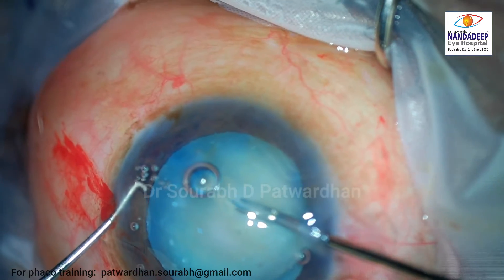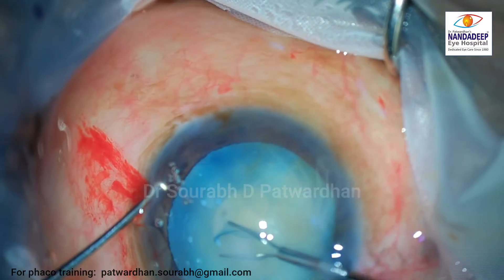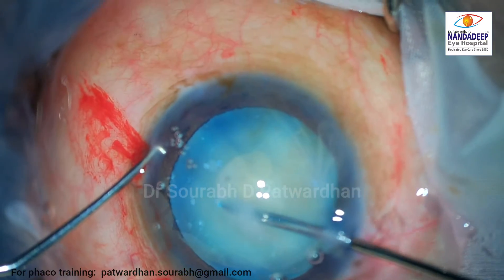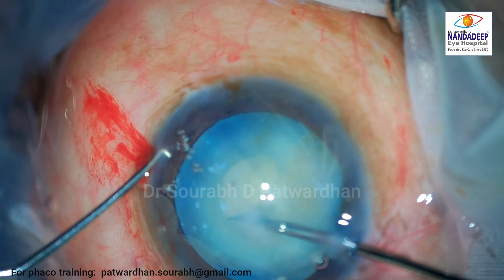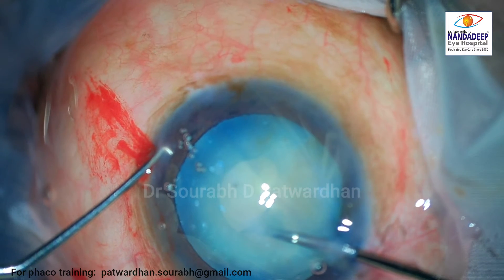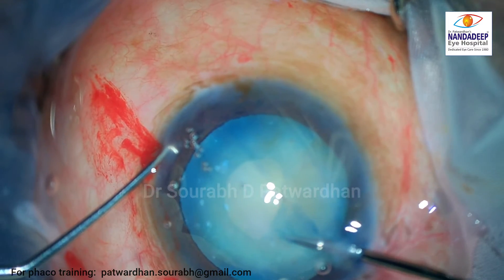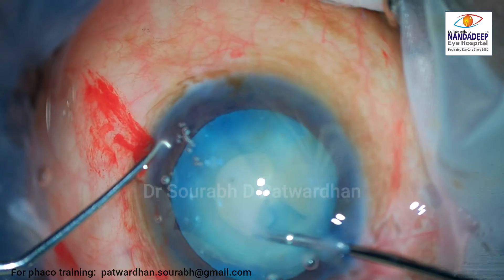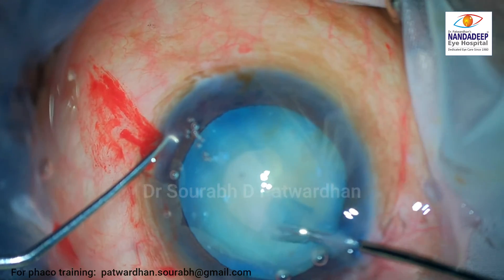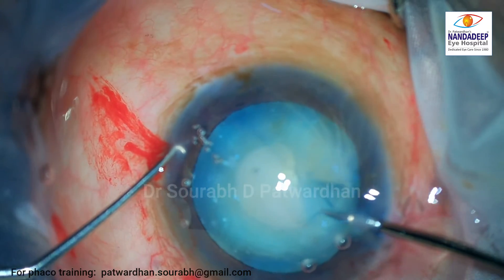Here the surgeon is trying to do the capsulorhexis using microcapsulorhexis forceps from the side port incision, which is a smaller incision. In cases where there is no intumescence, I would advise going from the main incision — it improves the maneuverability of the forceps, and there is less risk of capsulorhexis extension because the lens is not intumescent.